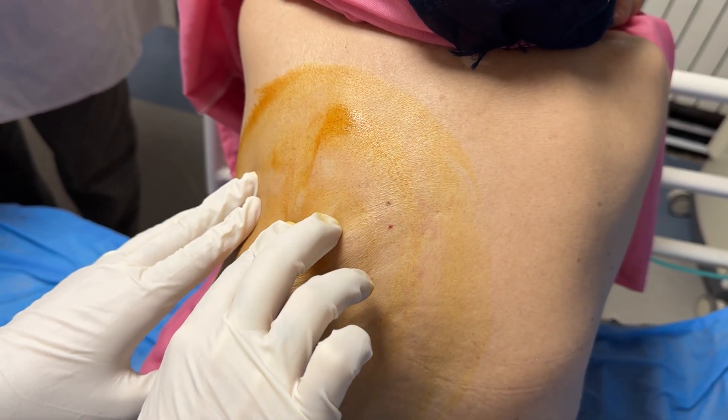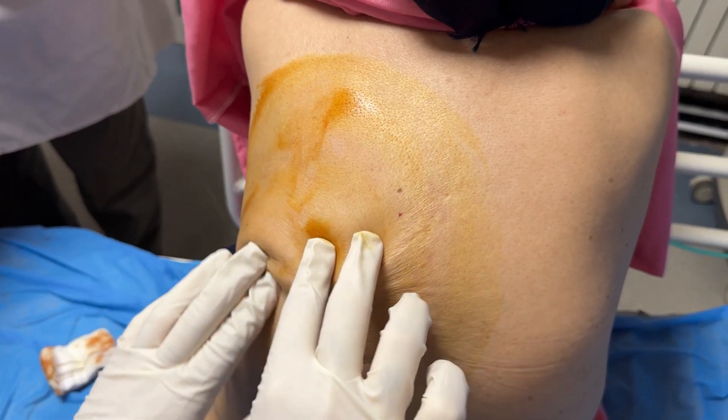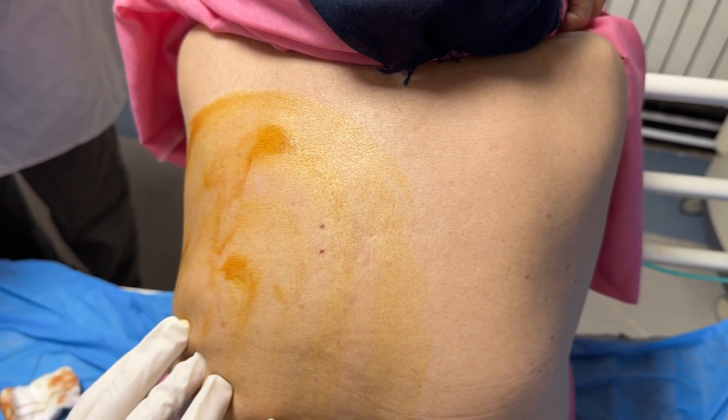After sterile prep and drape and generous local anesthesia, please make sure the patient is comfortable.